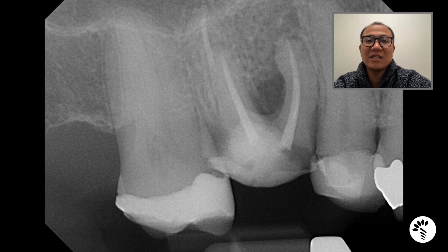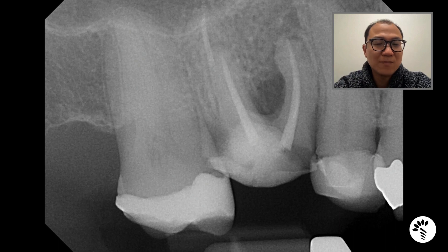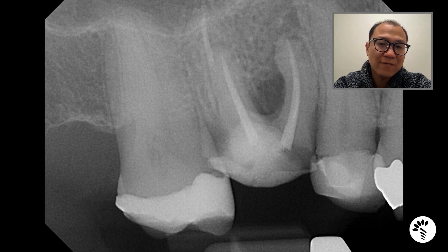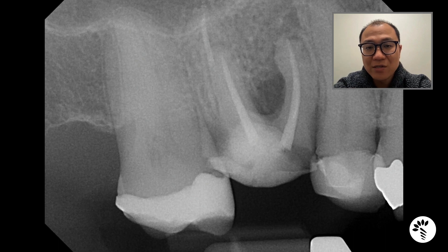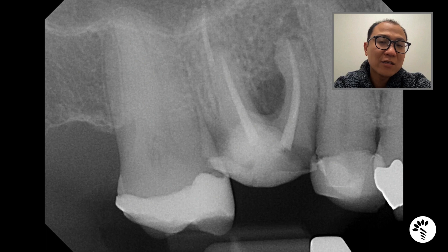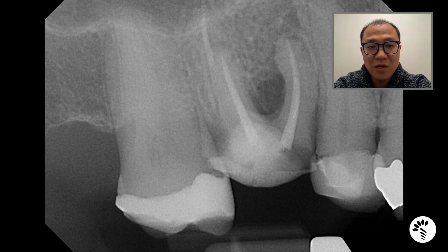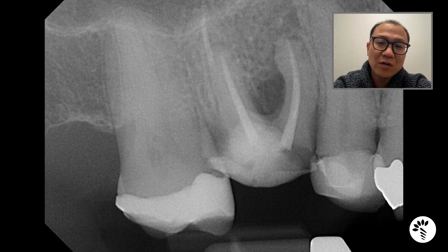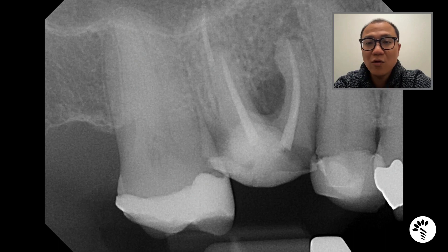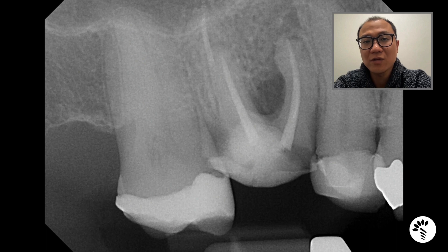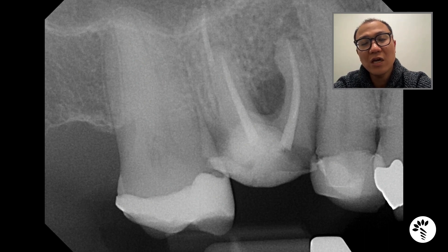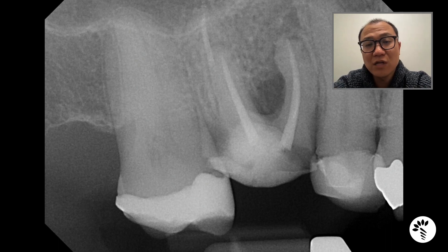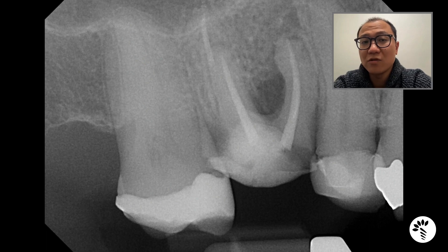You can clearly see that Lisa lost some vertical height of bone, especially around the mesial aspect. When doing the extraction, I want to make sure I clean out the socket completely where bone has been replaced by granulation tissue. I want to restore not only the horizontal dimension of the socket but also grow the bone coronally to make up for the vertical bone loss. There is also a sinus in proximity, especially to the palatal root, so I want to ensure there is no communication between the palatal root socket and the maxillary sinus — and if there is, I should repair it at the same time.